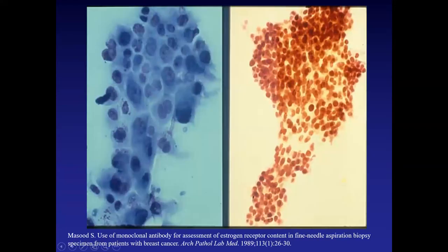This is the first slide of the use of fine needle aspiration biopsy and cytologic preparation using monoclonal antibody to try to assess the presence or absence of estrogen receptor. And you can see very nice brown nuclear staining that shows expression of estrogen receptor in this malignant fine needle aspiration biopsy. They're almost like a twin slide: that one is the morphology, which is malignant, and this is an expression of a poorly differentiated breast cancer, and of course, the corresponding hormone receptor. This is one of the first reported cases of using monoclonal antibody for assessment of hormone receptors.